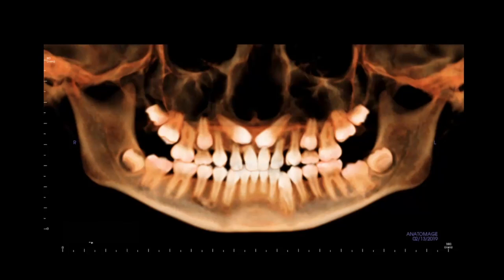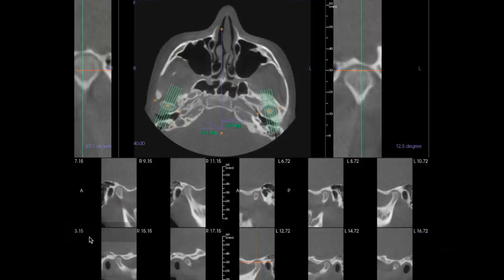Okay. So we talked about how are we getting these? Are we leaving her without centrals, or are we doing central pontics? And then how are we applying traction to those teeth? Okay, so design some mechanics to bring the canines more palatally, and that would allow you to keep pontics in more facially. All right, let's just rule out some other things real quick.